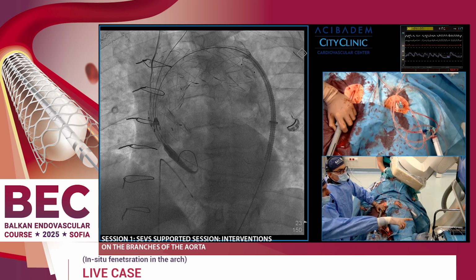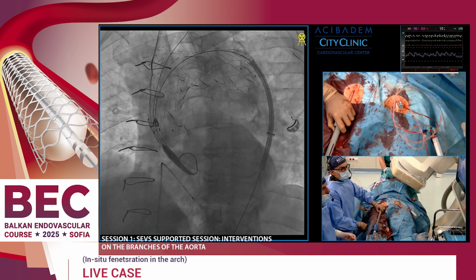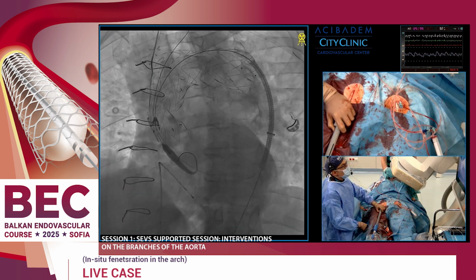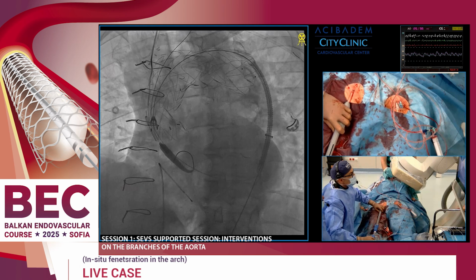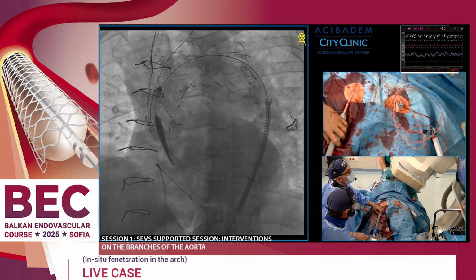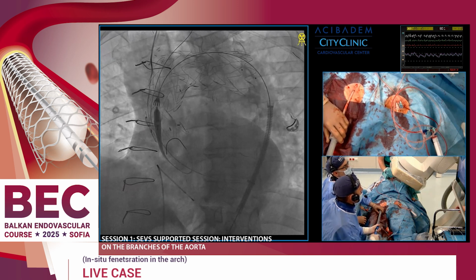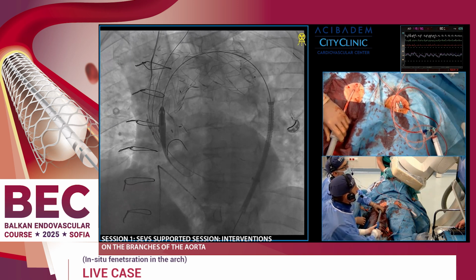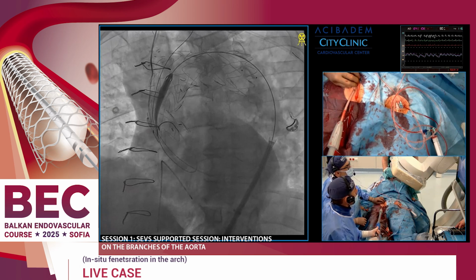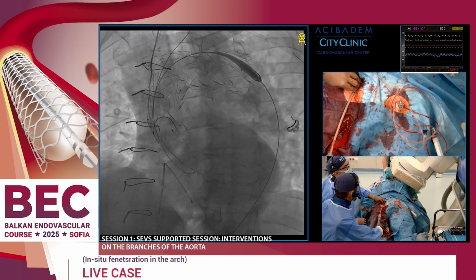Okay. Professor Stankovic is showing me that there is almost no difference in the pressure. That is, in fact, okay, excellent. Yeah. Let's push-pull. The straight position for the remove. Okay.